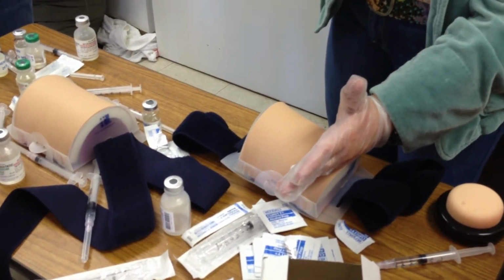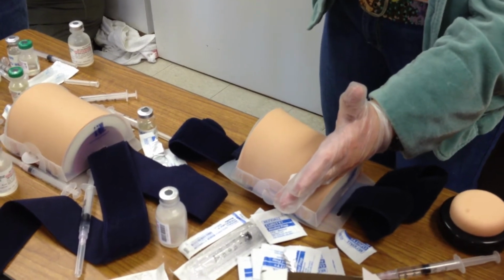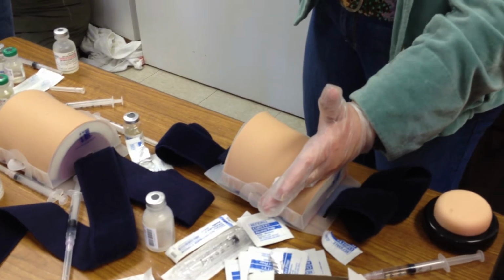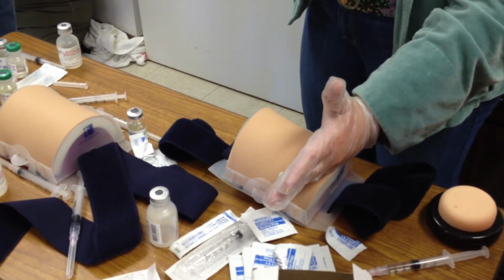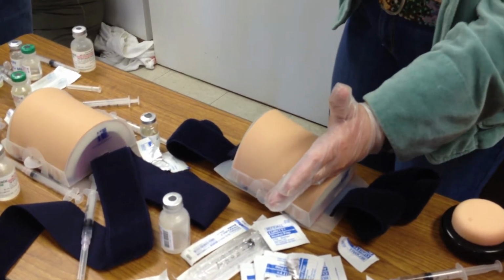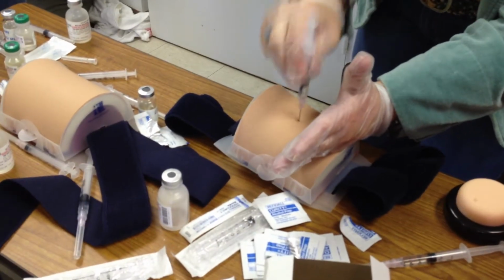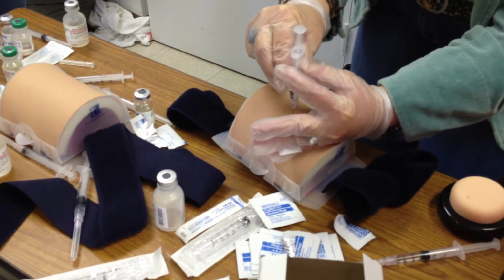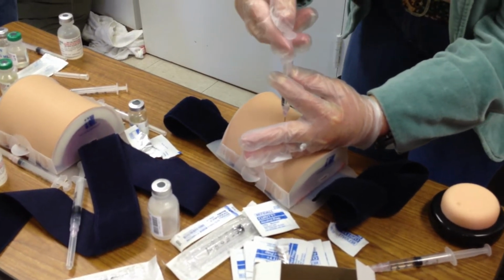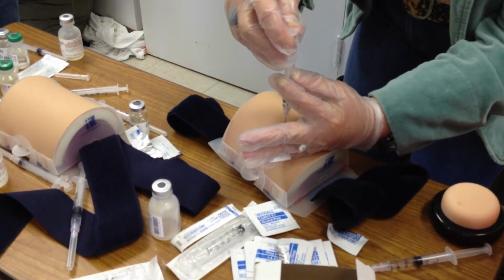Don't be afraid and don't hesitate, because the worst thing you can do is go and push, push, push, push, push. You want to slide in. These needles are meant to pierce the tissue, and they're silicone coated so they'll slide through the tissue easily. But you've got to give it enough force by dart technique to get in. Okay? So dart in. Then I'm going to reach up with my pincher fingers up high enough that I can see down here. Now this is aspiration. You're going to reach up and you're going to pull back on your plunger.